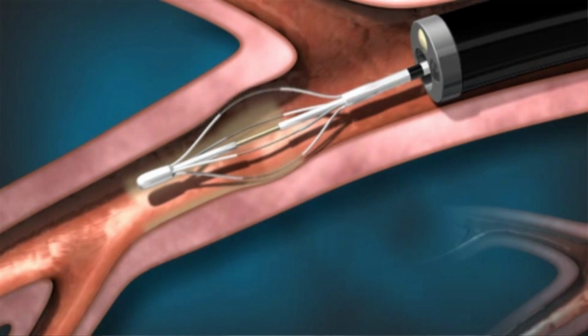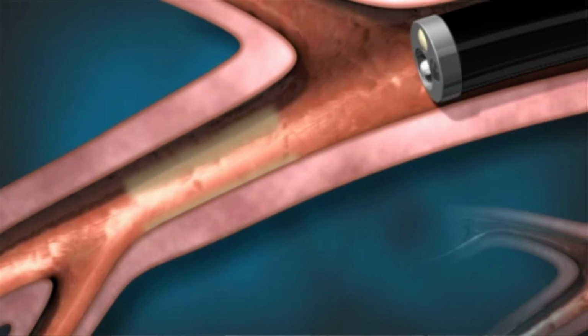So basically the procedure starts with the distal airways and works its way proximally, so from further to closer in. And we generally activate the machine about 40 to 60 times, depending on the person's size of their lung and how the procedure is going. And then the patient goes home on the same day and then comes back 3 weeks later for another procedure.